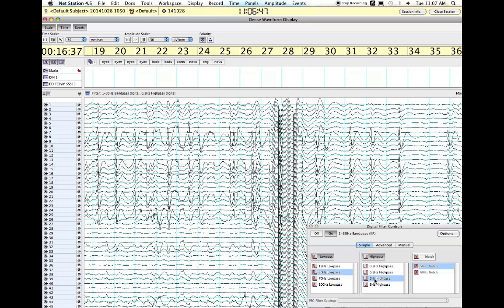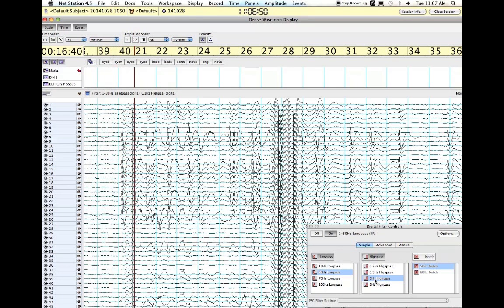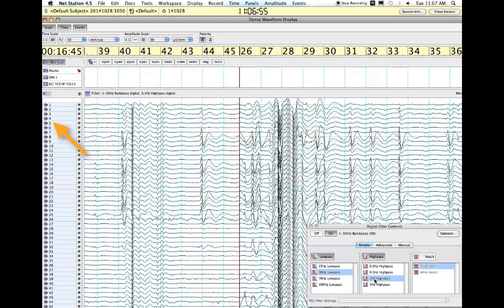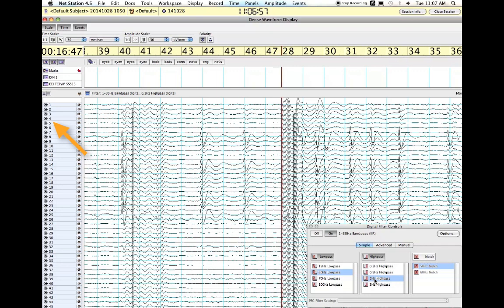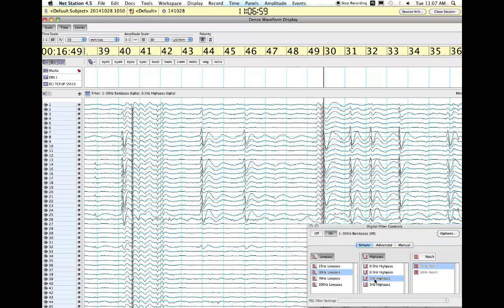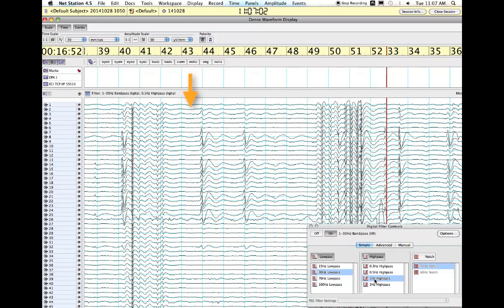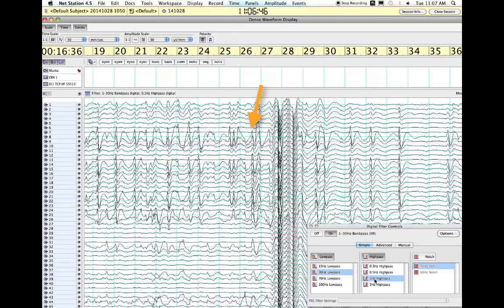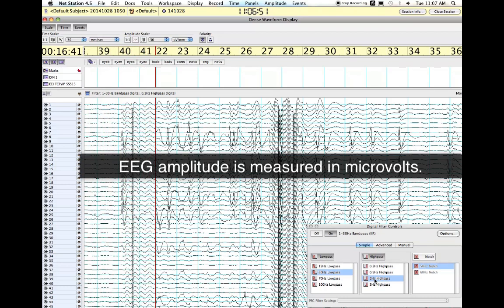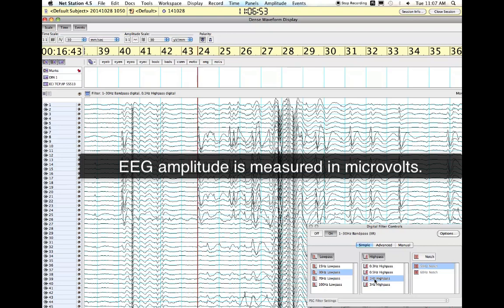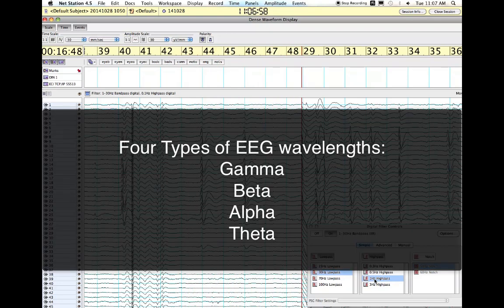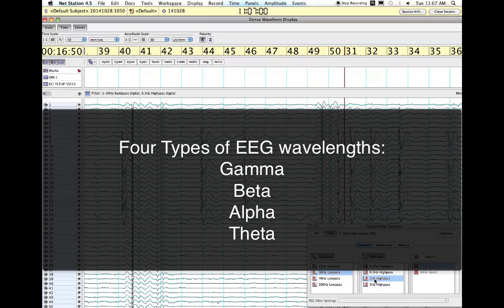This is what EEG data looks like as it's been recorded on the data acquisition computer. The numbers down the left side correspond to the electrodes on the EEG cap. The tiny amplitudes represent brain activity, while the larger amplitudes represent muscle movement such as eye movement recorded on the EOG electrodes. EEG amplitude is typically measured in microvolts, and the wavelengths are divided into four main groups determined by their frequency oscillations.